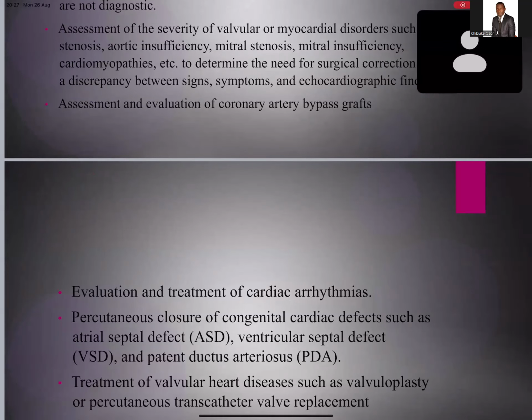as left heart catheterization. Meanwhile, it's important to know that the procedure is a multidisciplinary procedure requiring a cardiologist, especially an interventional cardiologist, having experts in diagnosis and interventional cardiac catheterization, cardiovascular technologists to assist the cardiologist, also administration of drugs, a radiographer, and an anesthesiologist to assist in sedation.